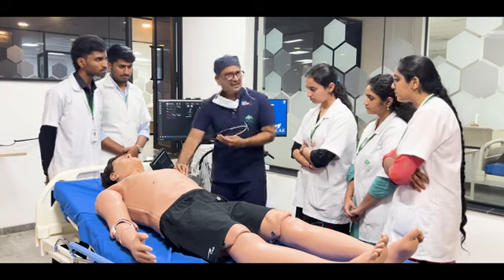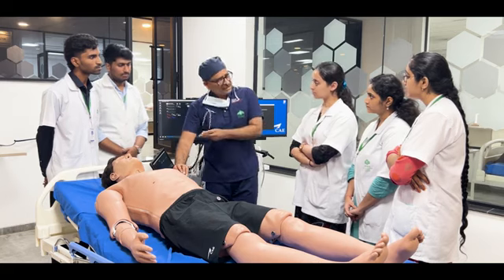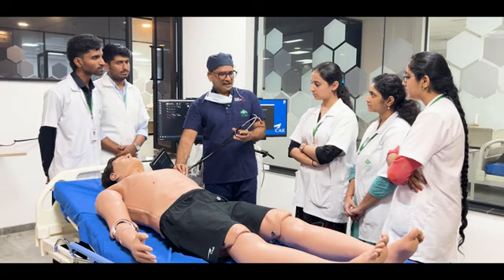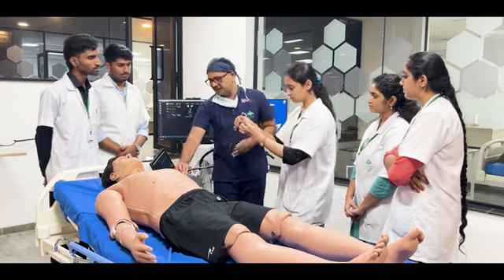Here the murmur starts with the first heart sound, merges with the second heart sound. We cannot differentiate between S1 and S2. It's a holosystolic quality. Can you hear me? All of you can try this auscultation?